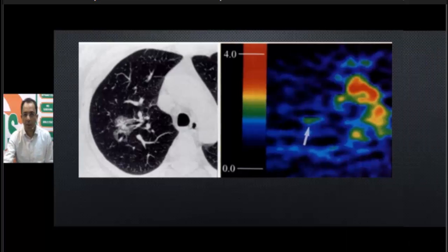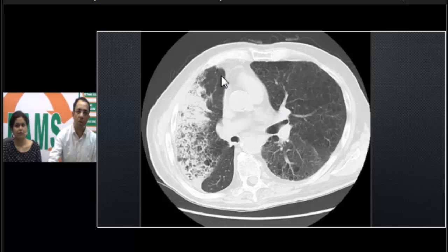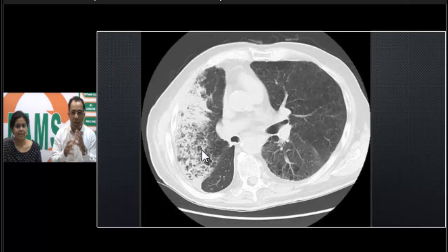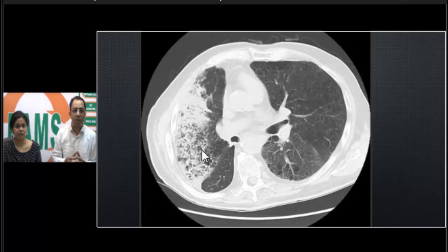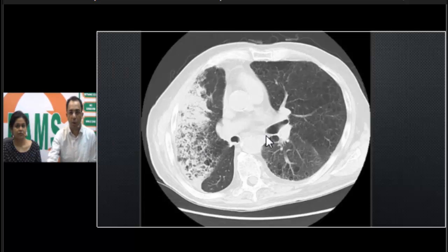Another radiological appearance of this tumor is a consolidated form — you can have a whole consolidative area with air bronchogram. This air bronchogram or open bronchus appearance is again very typical of bronchoalveolar cancer. This is why these patients would initially be radiologically misdiagnosed as pneumonia, because consolidation with air bronchogram is classically associated with pneumonia.